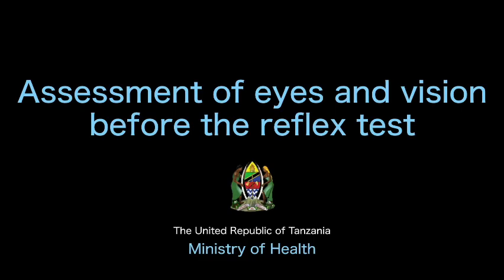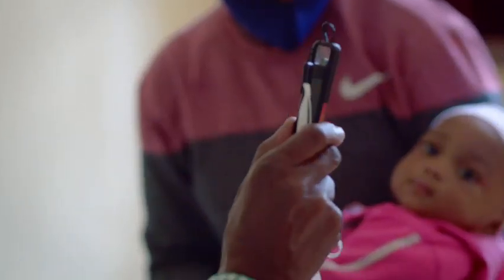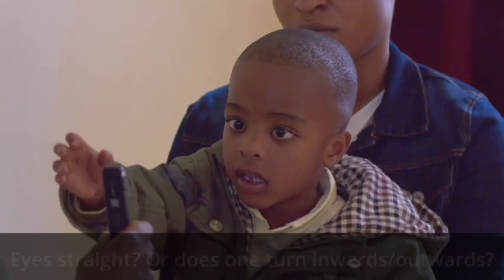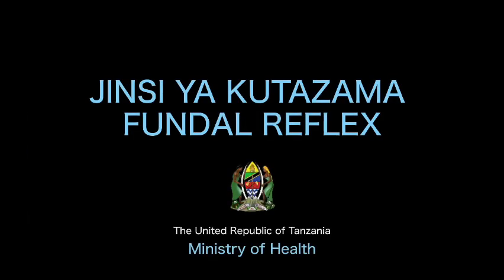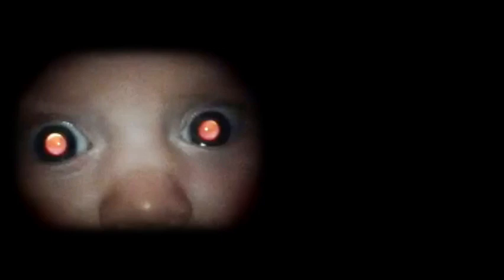Tips on the assessment of the appearance of eyes and observable visual function are described, including fixing and following faces, returning silent smiles, following lights, and engagement with pictures, as well as assessment of squint and for the presence of nystagmus. Then, the actual technique of performing the fundal red reflex test in newborns as well as older children is shown, alluding to the different appearances amongst babies of different degrees of skin pigmentation.